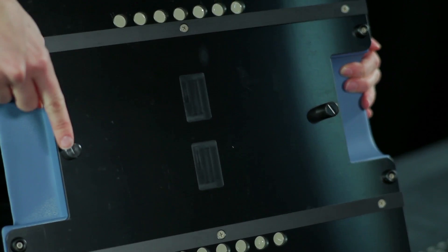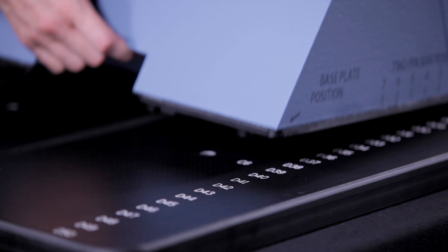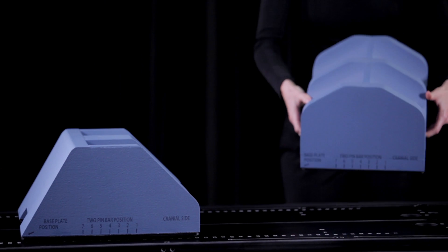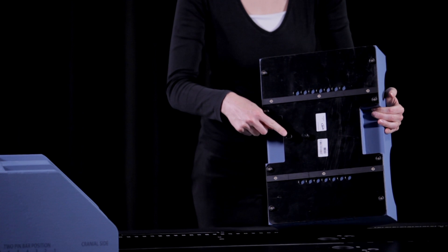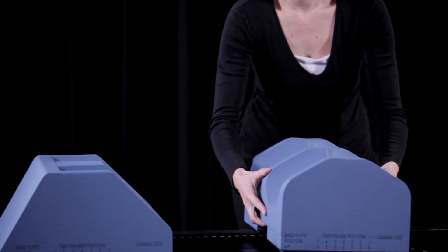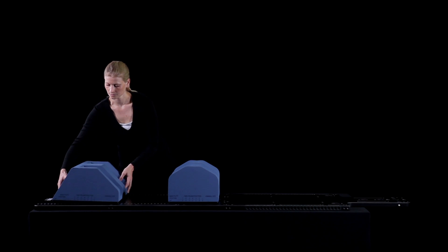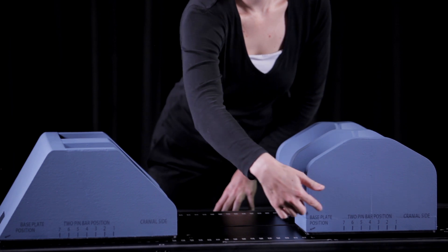The cushion to support the feet has positioning bosses that drop into the holes in the baseplate. The cushion to immobilize the knees has the same type of bosses for fitting into the baseplate. Moving the cushions is easy so that you can find the most comfortable position for your patient. The engravings on the baseplate make sure that both cushions are indexed in a reproducible way.